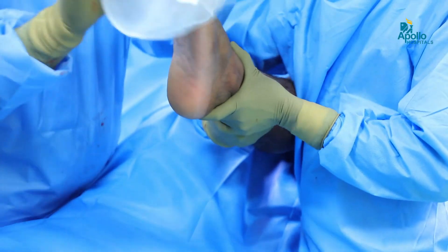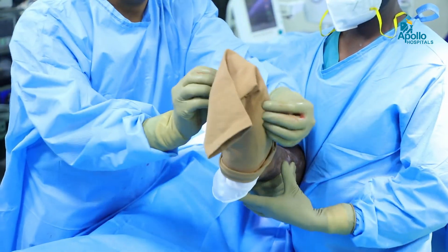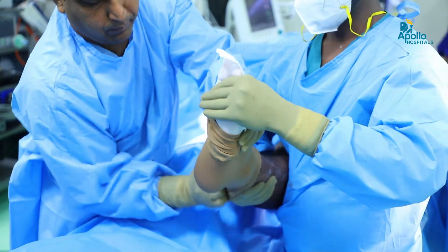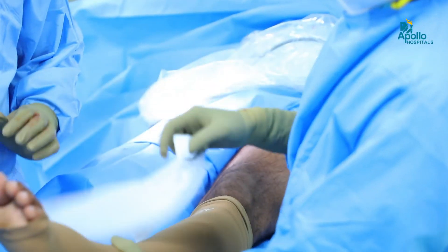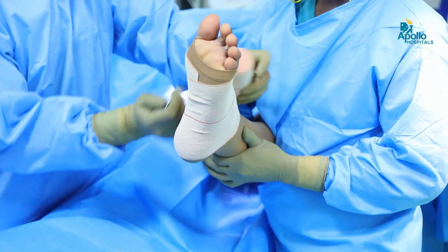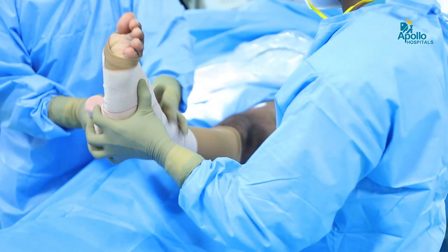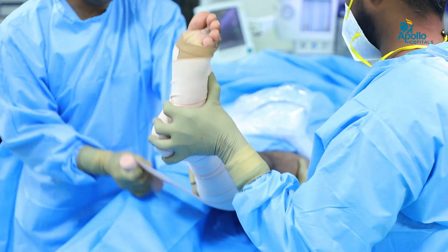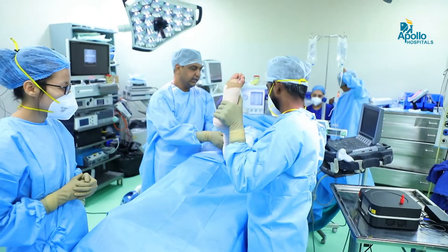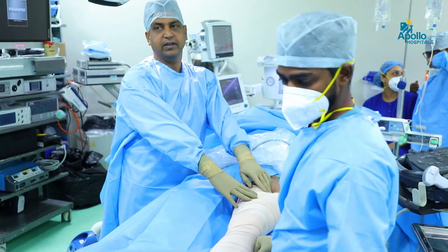Once the procedure is done, we apply stockings and compression crepe bandage for 48 hours. After that, the patient goes home only with stockings. Initially for 48 hours, we allow the compression to be there continuously throughout the day. But after 48 hours, only daytime stocking wear is adequate for this procedure.